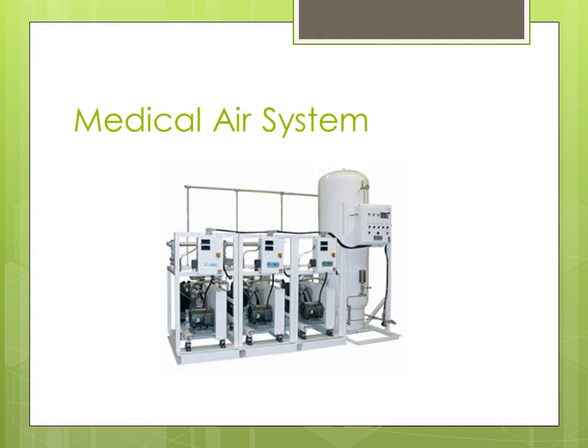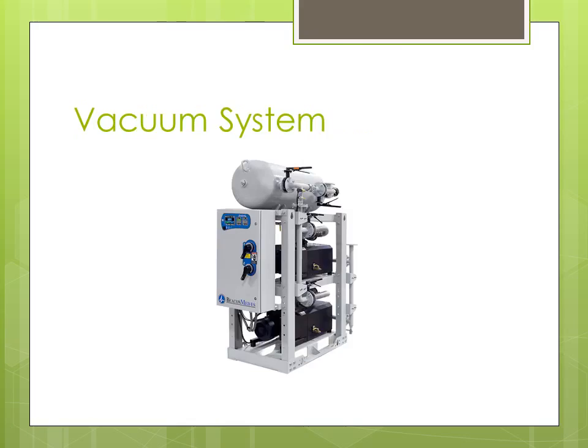Here's an example of a medical air system. One thing to keep in mind about medical air is that when you deliver medical air, it needs to be very, very clean, obviously, and it also needs to be dry. So on most medical air systems, you'll find either some type of refrigeration system that dehumidifies, or you'll find desiccant filters that are used to dry. And of course, both those systems require a fair amount of maintenance. I think that's the one thing that sometimes gets missed with these medical air systems. Otherwise, they're compressors and motors and just the storage tank.